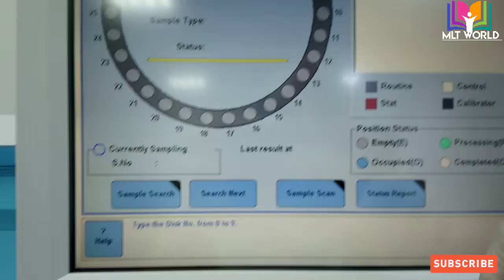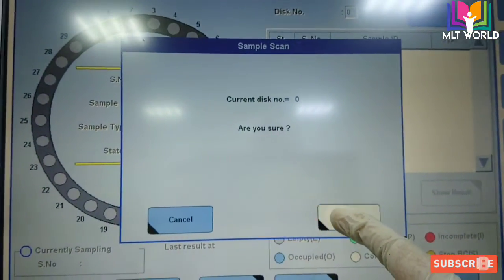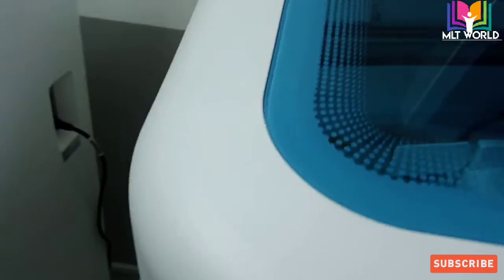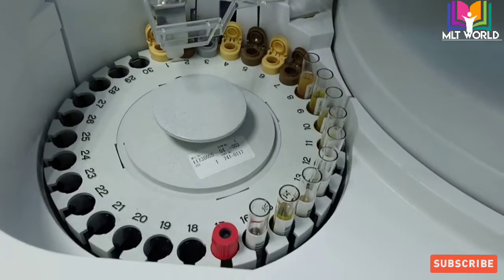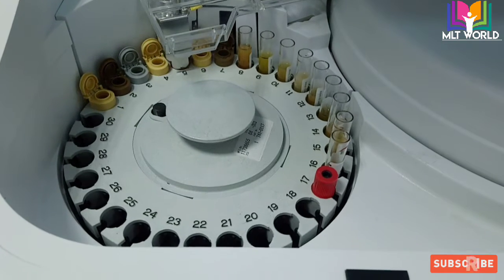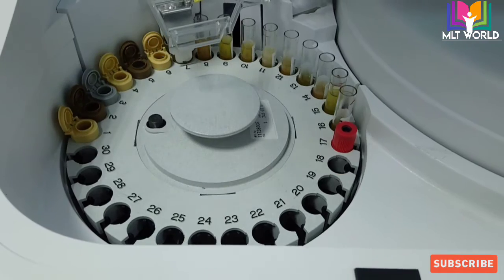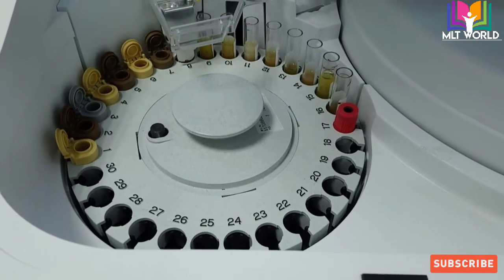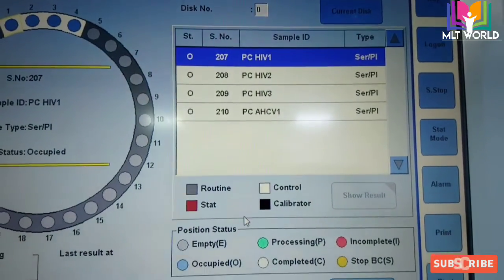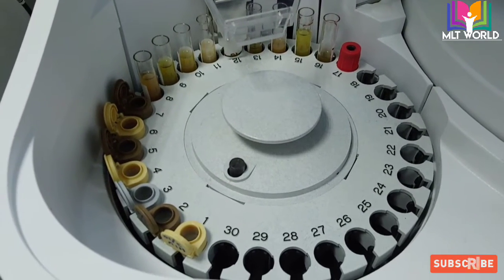Go to sample tracking and click sample scan. The current disk shows zero, meaning this is the first disk. If you have more samples and the stop tube has been reached, you can change the disk position and run again. The machine is now reading barcodes for each sample. Once sample scan is complete, we will program the test orders for patient samples — for controls, no programming is needed as the machine programs them automatically.